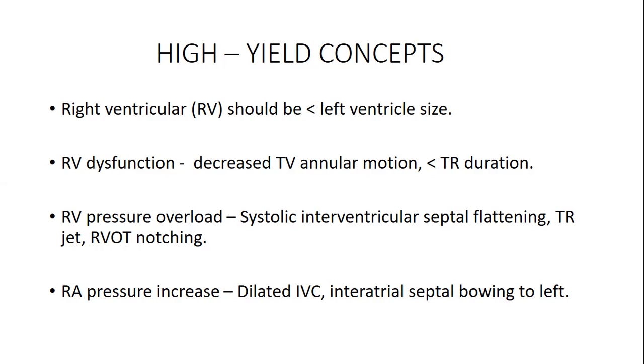By these terms, what I'm trying to emphasize is that when you have right ventricle pressure overload, I'll explain what this pressure overload is. You also have to look at specific things, like systolic interventricular septal flattening, which sometimes we call the D-shaped. I'll explain all these concepts and how they can help you understand a few things. These are indirect concepts that you can look at even before you do certain quantification of echo parameters.